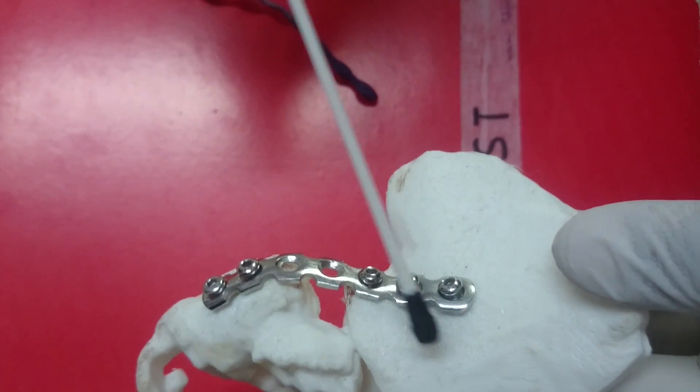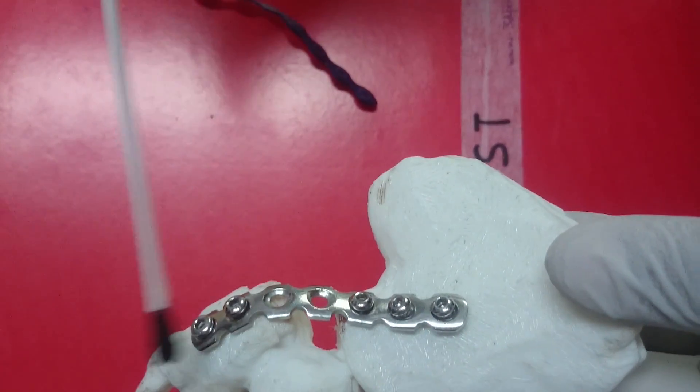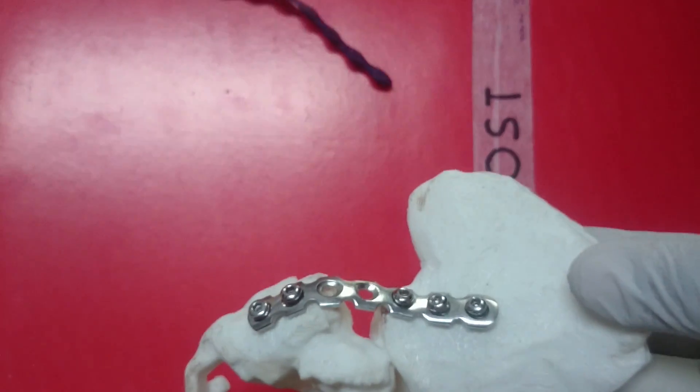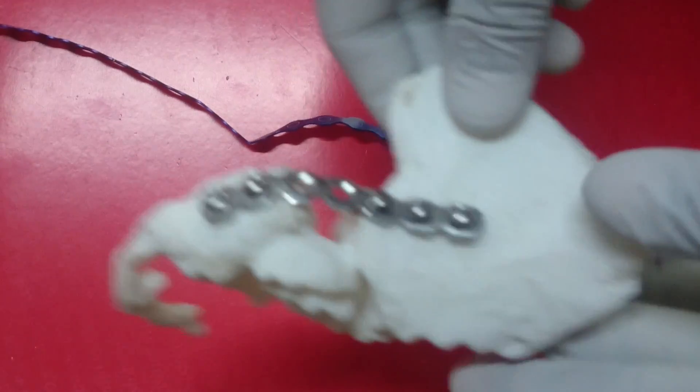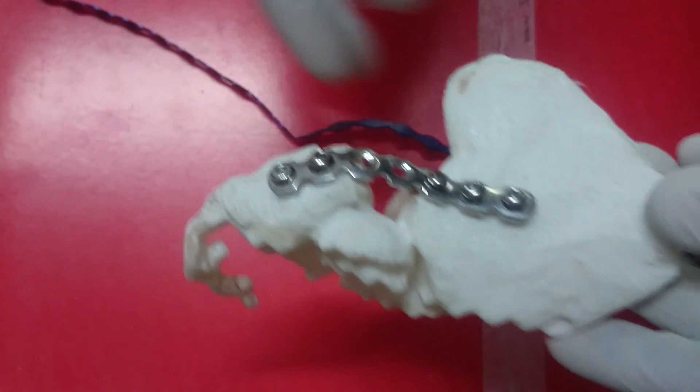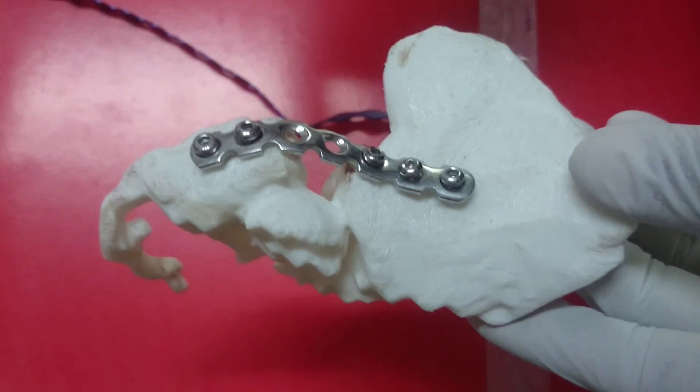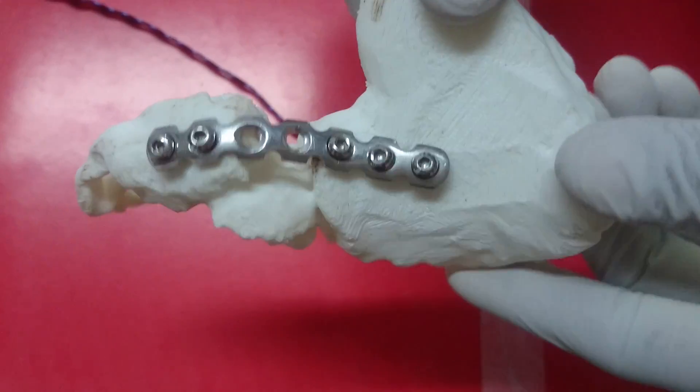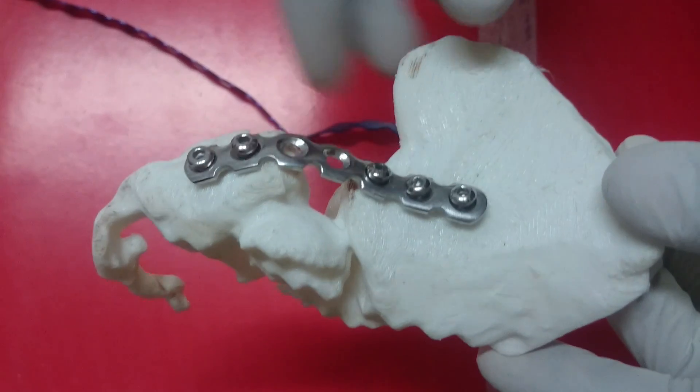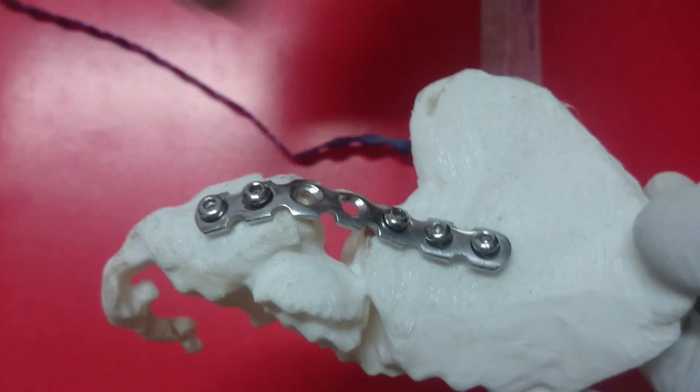So in this case, we planned this trajectory like these and we decided to skip these holes. Ensuring that you had this template as well as this model onto the table, the sterile model would help intraoperatively judge your fracture reduction. Also, once again reconfirm your trajectories and help in placement of the implants.